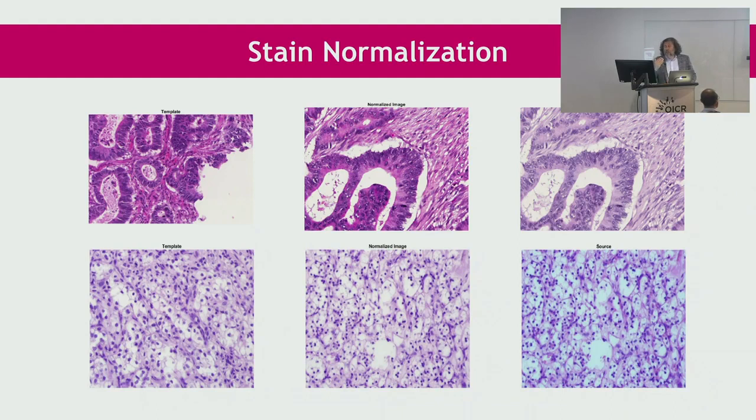So what have we done with the color variation so far? Well, the pathologist has dealt with it like everything else. If the staining has changed suddenly because we have a new histotech, or the H&E supply source has changed, or whatever, it's the pathologist who has to deal with it. And he or she has to adjust their optics or understanding, pay more attention.